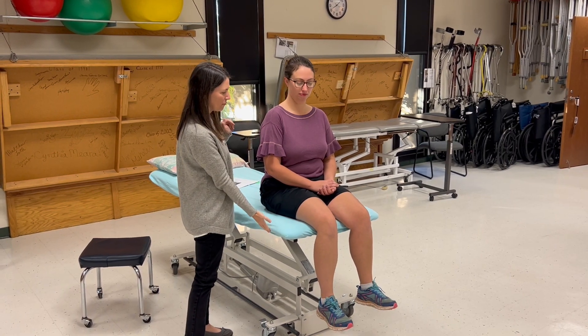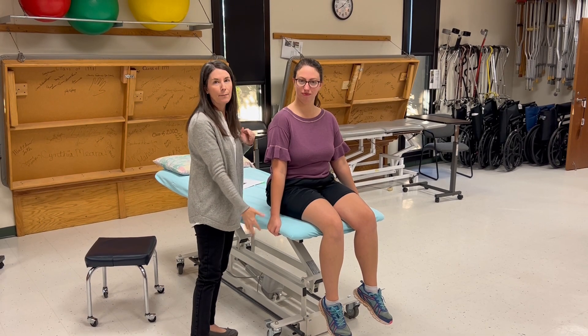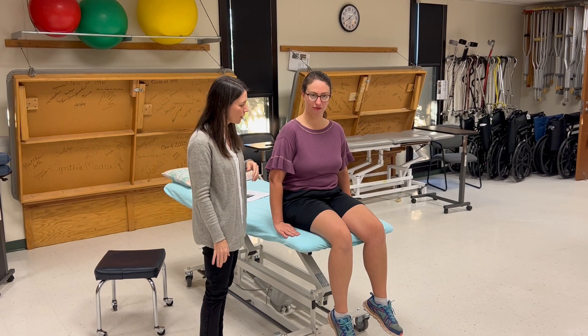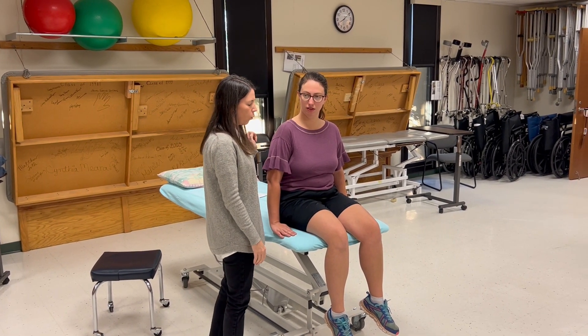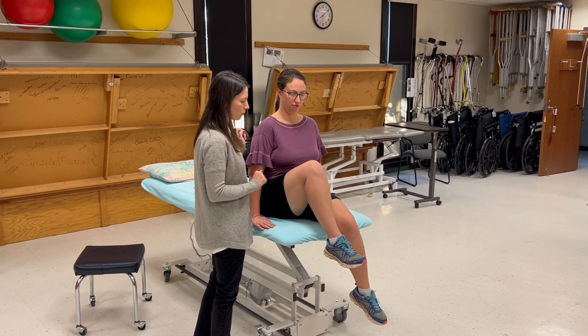The patient may want to wrap her fingers around the edge of the table — that's a compensation, so we're not going to let her do that. Hands flat on the top. I'm going to ask her to bring her knee up toward the ceiling as high as it'll go.